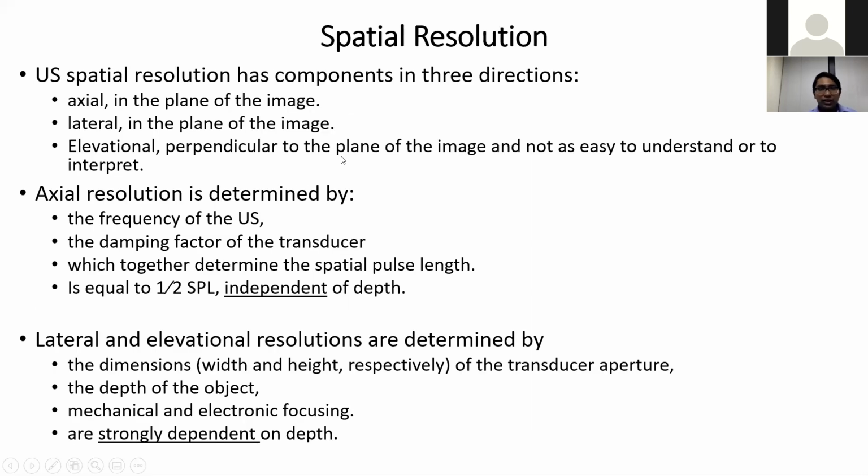So as I mentioned earlier, for spatial resolution, both lateral and axial resolution, the smaller the resolution in millimeters, the better it is. And similarly, it goes for the elevational resolution. So that is one parameter on which we judge the ultrasound image quality.